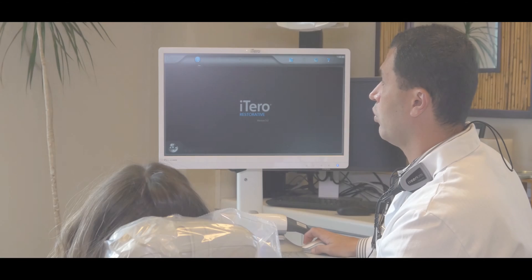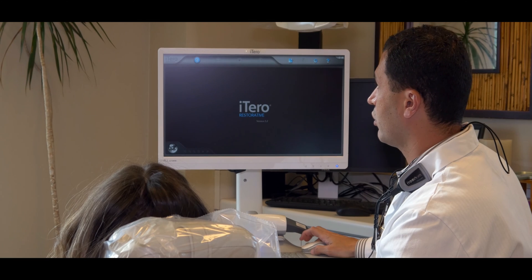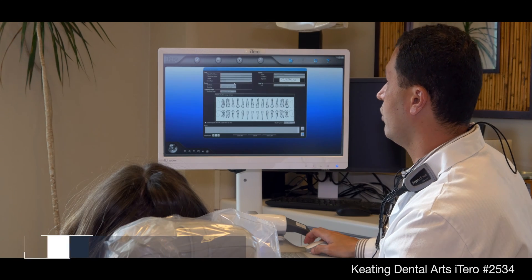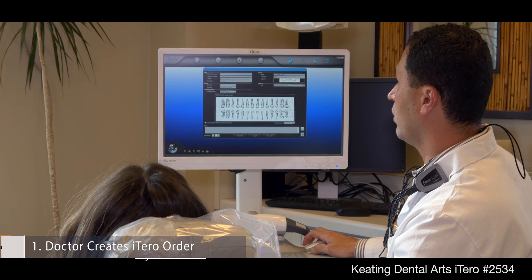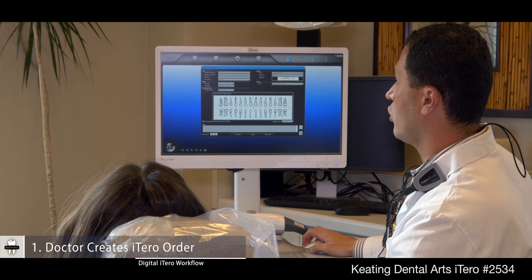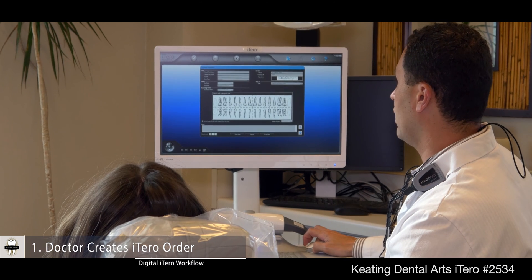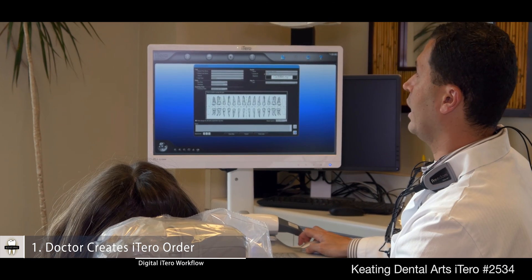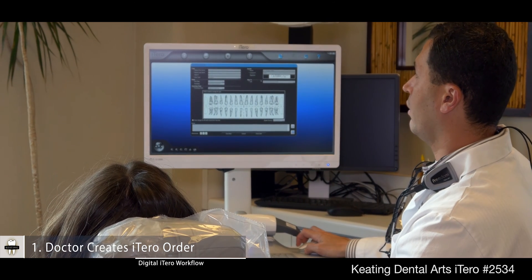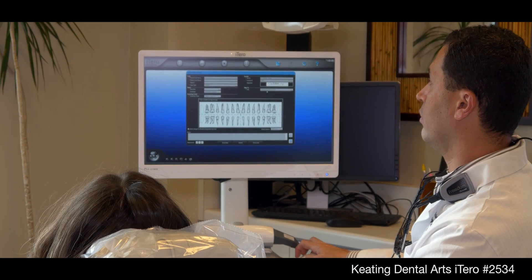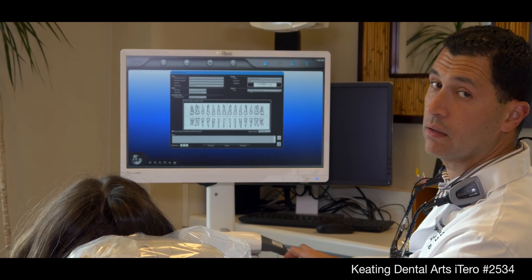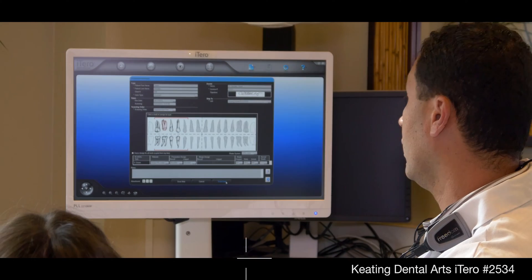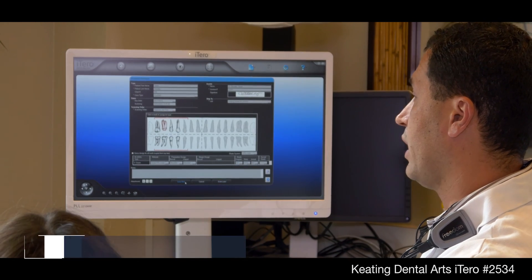That's the first thing you want to do — you want to do a new prescription. So you click Rx New and it prompts you with patient information, dates, tooth number. You already got everything entered and the lab that you commonly use, in my case is Keating Dental Arts. And then you say Scan Now.